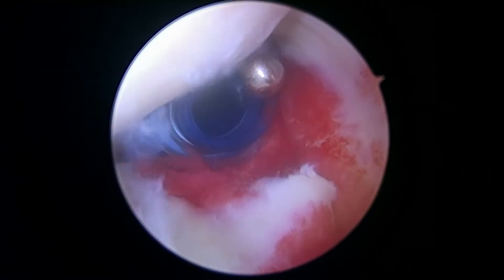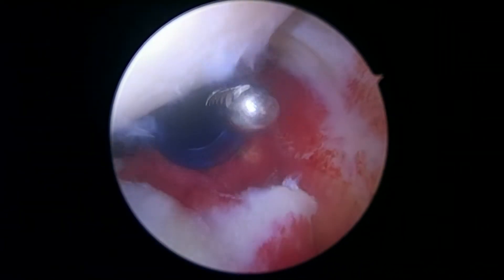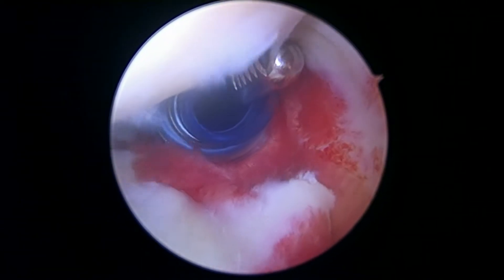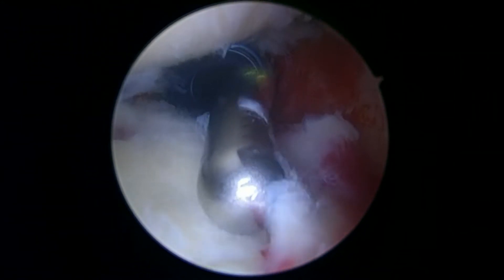We're going to complete the tenodesis using what we call a subpectoral technique because your rotator cuff is not torn. Your rotator cuff looks great there. So now we're just working on the rest of this labral tear here.